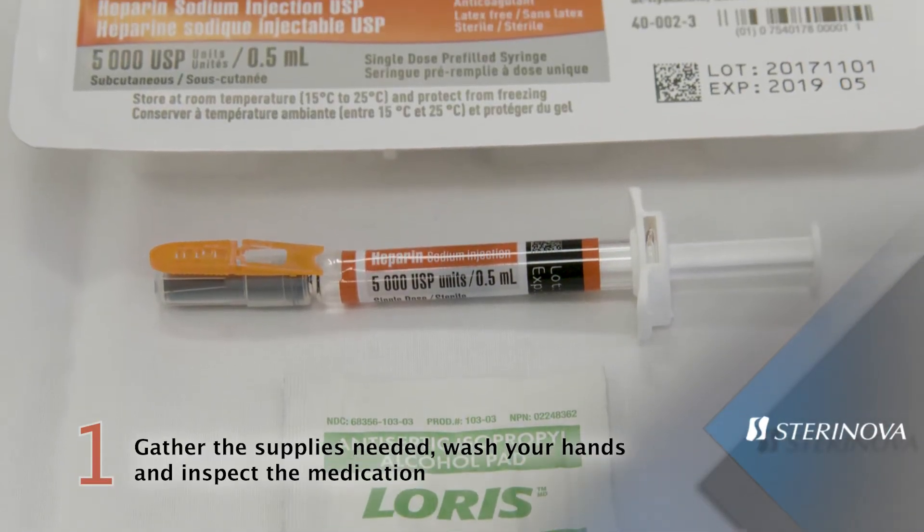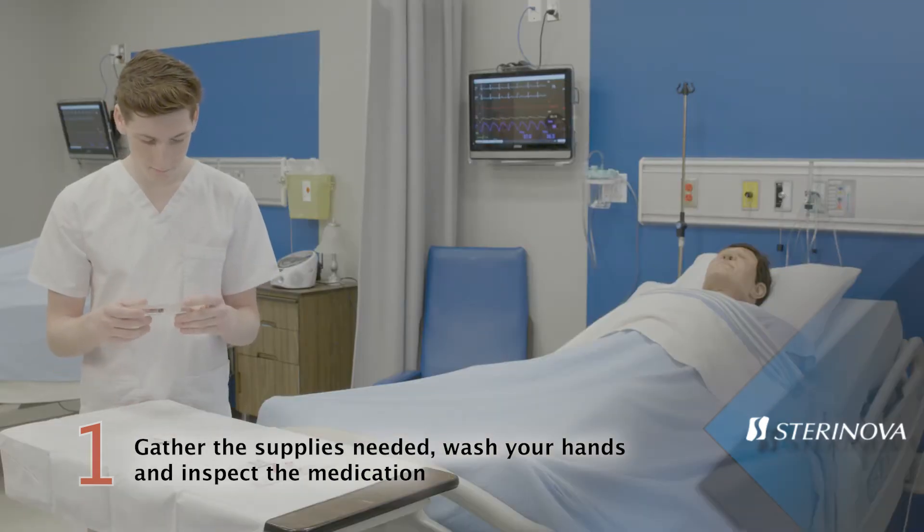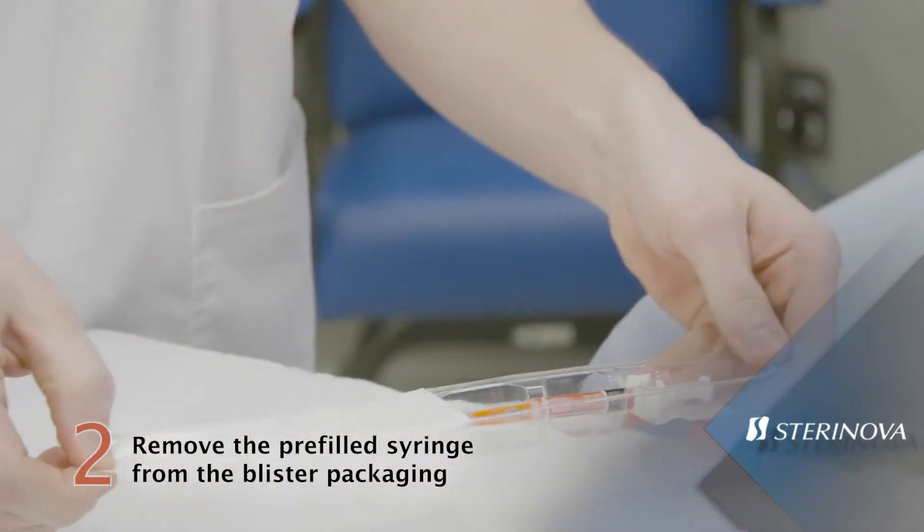Gather supplies needed for your injection. Make sure your hands have been washed before proceeding to the administration of the medication. Remove the pre-filled syringe from the blister packaging.